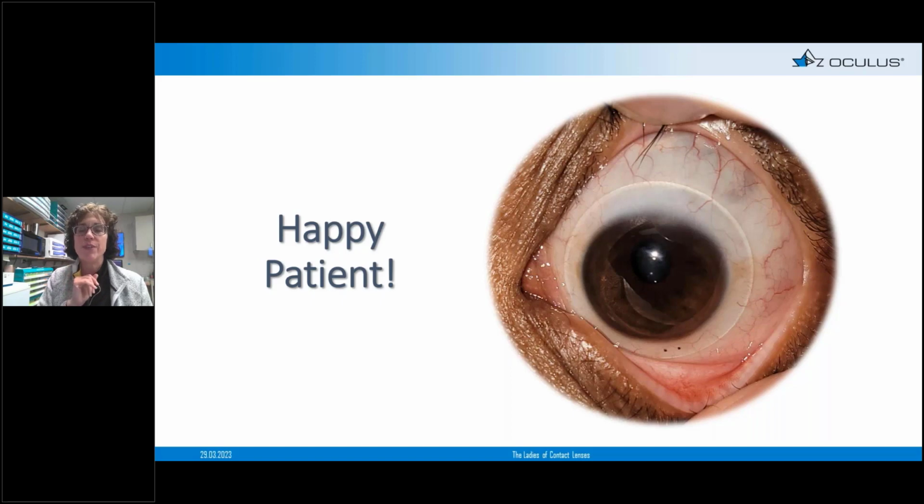Our next adventure with this young man is he does have a little bit of residual higher orders, and so we are going to play with putting the higher orders on this patient. So next slide. I guess that's it.